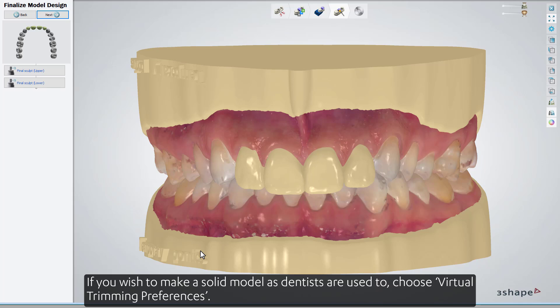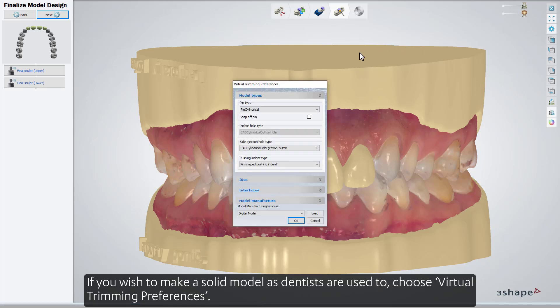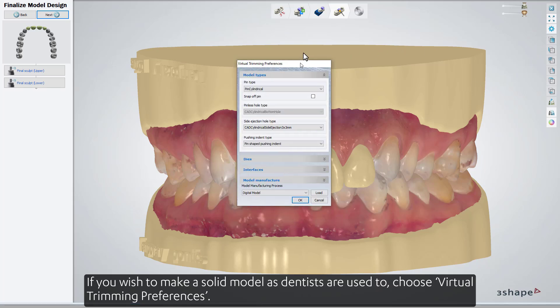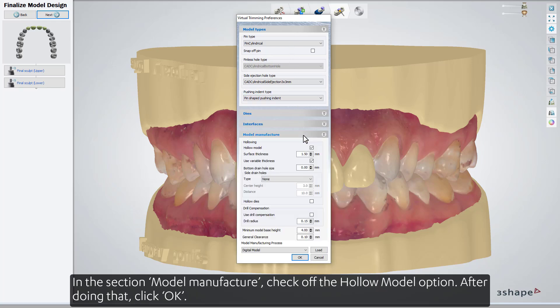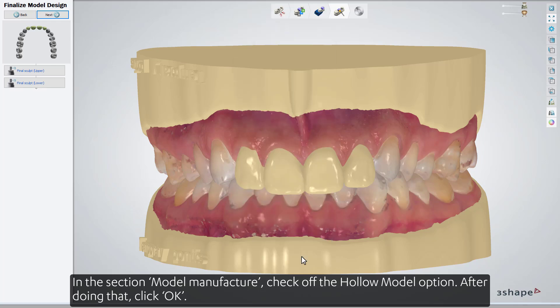If you wish to make a solid model as dentists are used to, choose Virtual Trimming Preferences. In the section Model Manufacture, check off the Hollow Model option. After doing that, click OK.